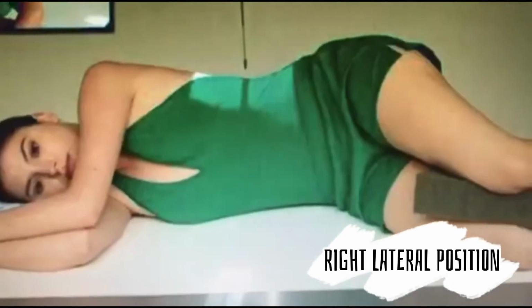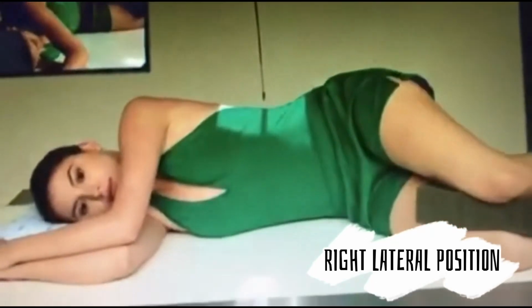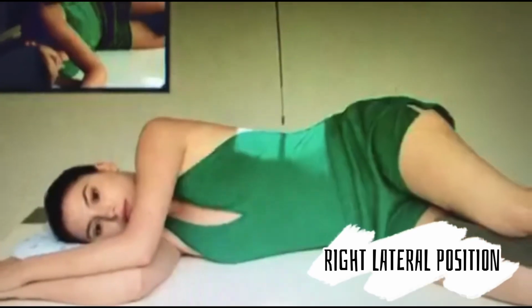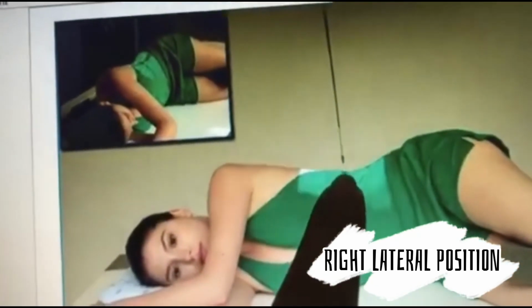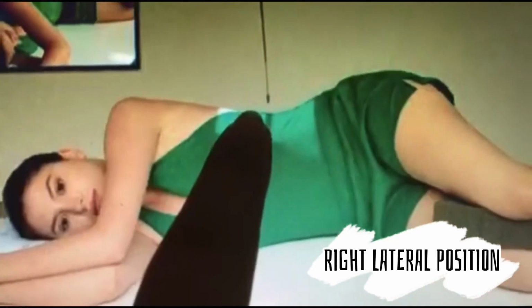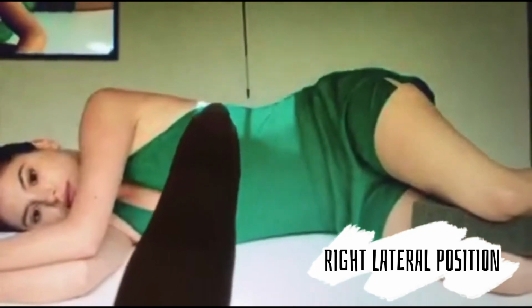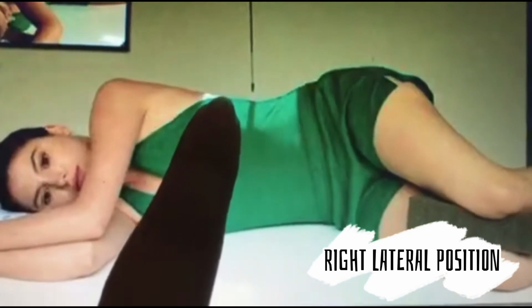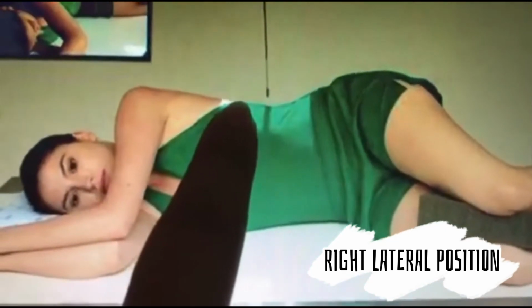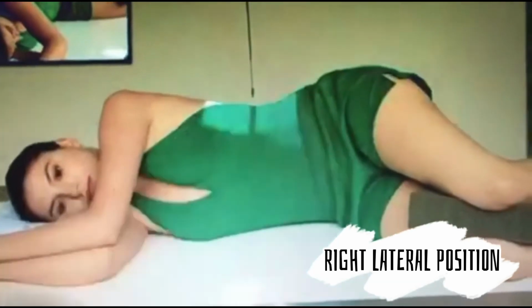Next is the hypersthenic patient. For the hypersthenic patient, we first locate the L1 again, here, and then center the ray 2 inches above the L1. That should be here. This is where we center the ray for hypersthenic patients, because their organs are higher and more transverse.